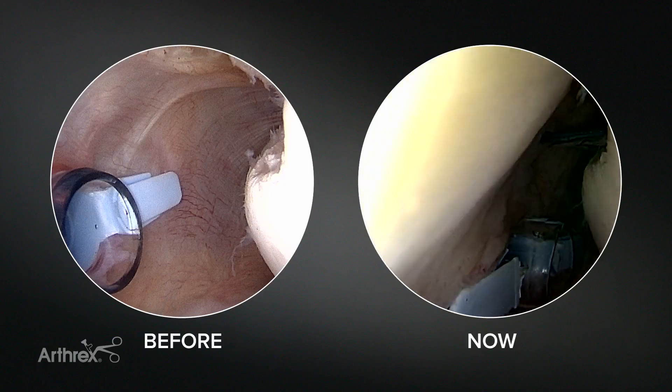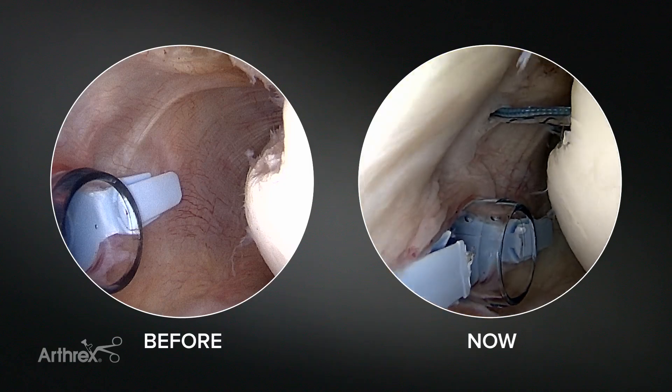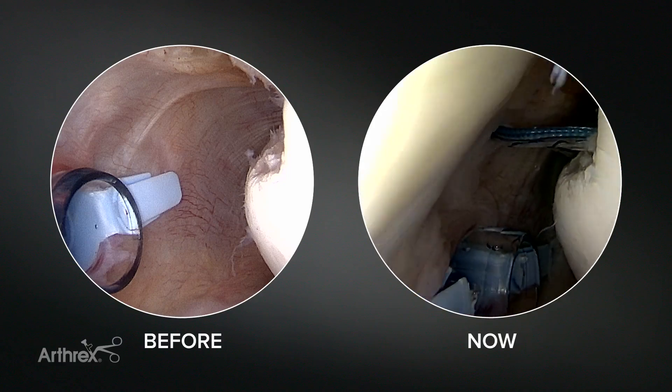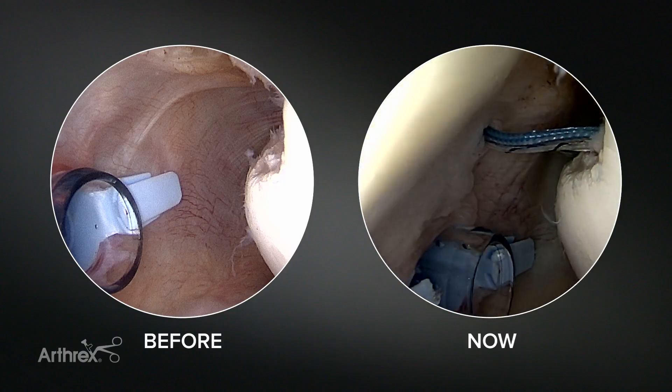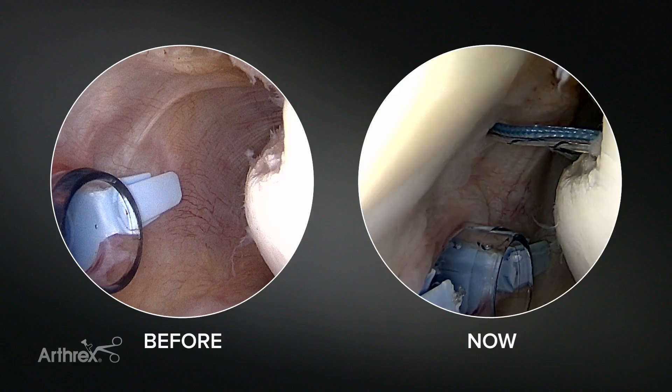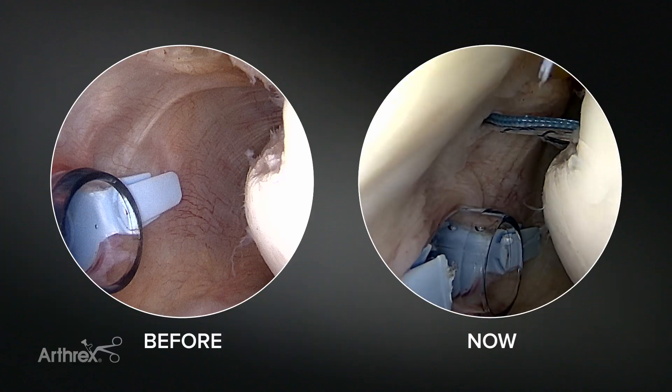This illustrates nicely how difficult it can be to do the remplissage at the end, because you can see already our space here is half that of which it was before. We're actually fortunate we can see in this case, because sometimes you get so much soft tissue swelling you can't see at all. So again it's important to make that decision at the very beginning.